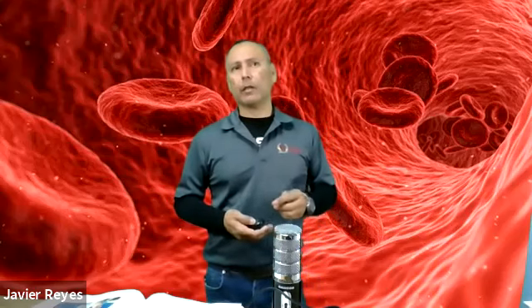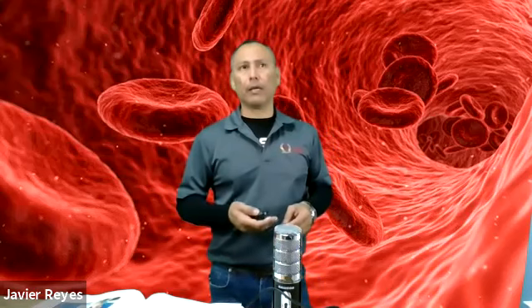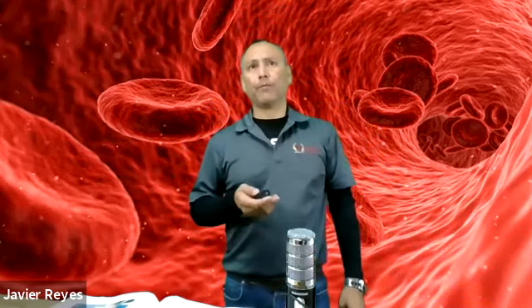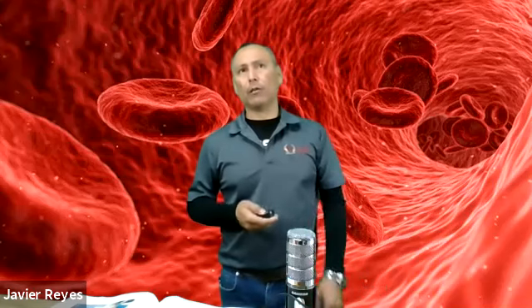Again, you must keep in mind what kind of tests you need to collect for. You cannot just collect any kind of specimen by capillary because it's not going to be sufficient blood for it. Or when there have been various attempts to collect from a vein and nobody has been able to collect it, you might consider a capillary puncture. Again, only if the test can be done with that small amount of blood.